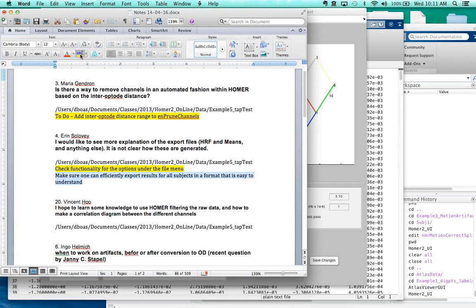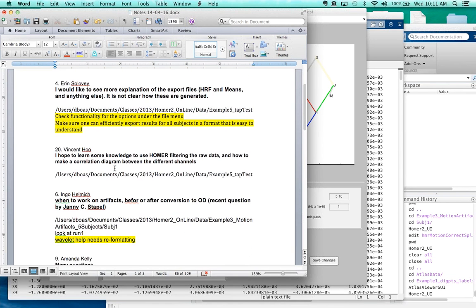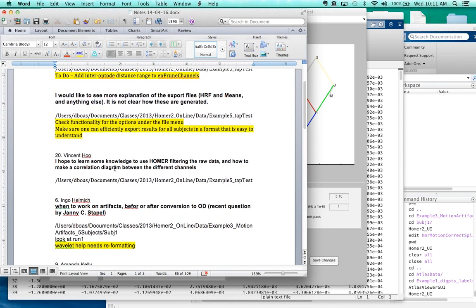Okay. So the next question from Vincent. Okay, so how to make a correlation diagram between different channels. Vincent, I'm curious, why are you interested in that?